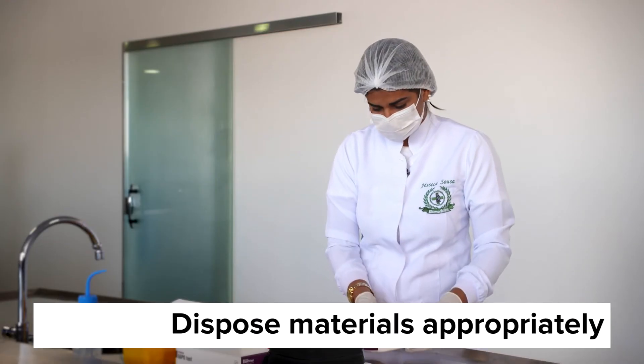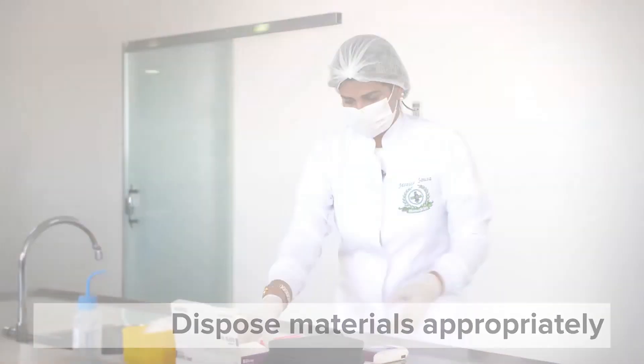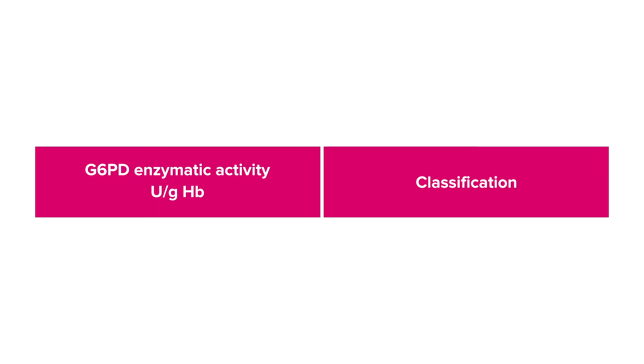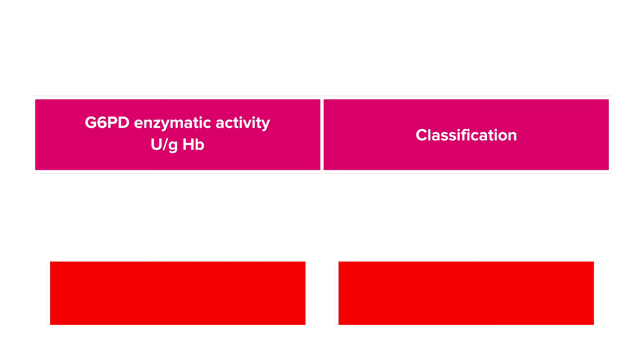Dispose used materials in appropriate containers. The G6PD test result will allow you to choose the appropriate radical cure treatment for a patient.